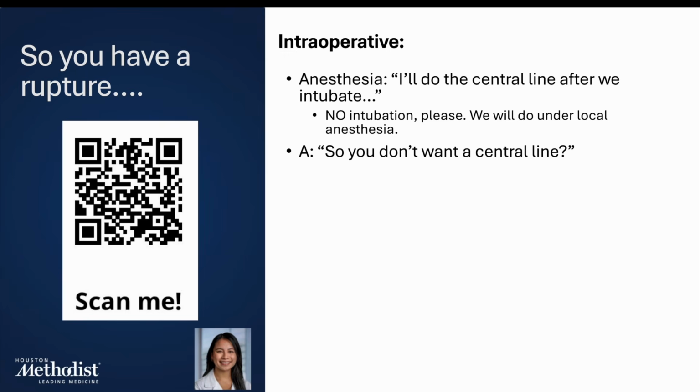Alright, so you don't want a central line? Yes, we do want a central line, however this should not delay the case start. You can be working from the groins while the anesthesiologist is working from up top. This should not delay prep or the case start. This would all be happening simultaneously.